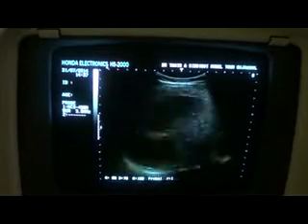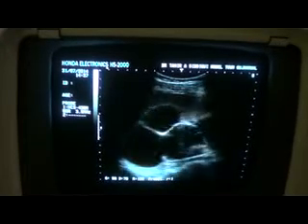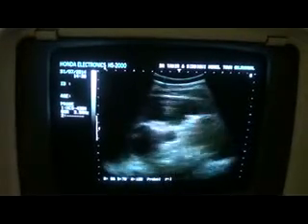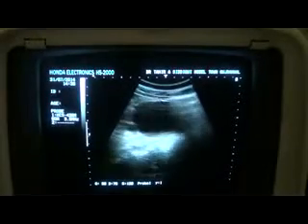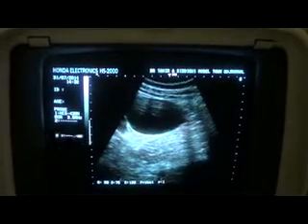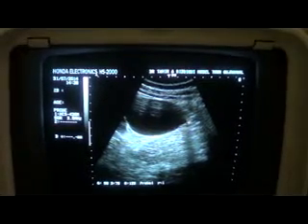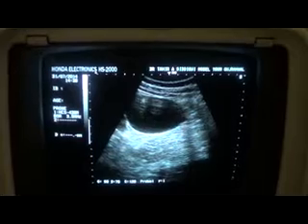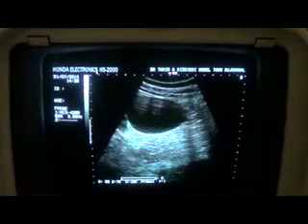and moreover, you will see that when I move the probe, these cystic appearing areas change their shape and appearance. Now, I will go in favor of, in this case, that this is a case of right pelviureteric junction obstruction. Now you see this is where the proximal ureter emanates. So there is no dilation of the proximal ureter. There appears to be a stricture over here. This is the dilated pelvis of the right kidney. And this is the iliopsoas muscle on which the kidney is gliding.